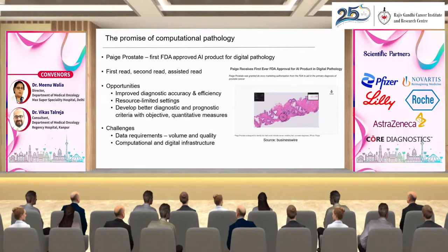Now, what are the challenges? The biggest challenge, as we will see in subsequent posters, is the volume of data, the number of slides required, which is enormous. The second issue is the quality of the data. The data has to be curated, properly annotated, and accurate. If you have faulty data, it will give rise to a poorly trained AI.